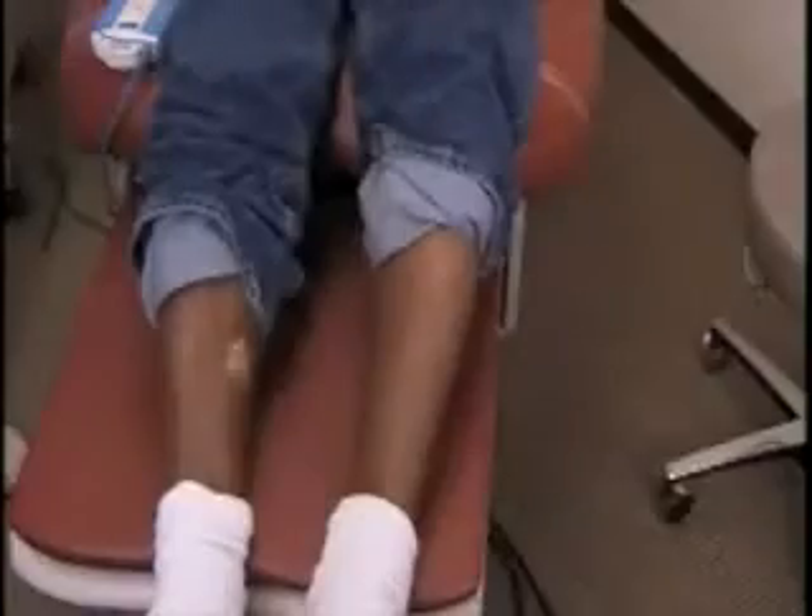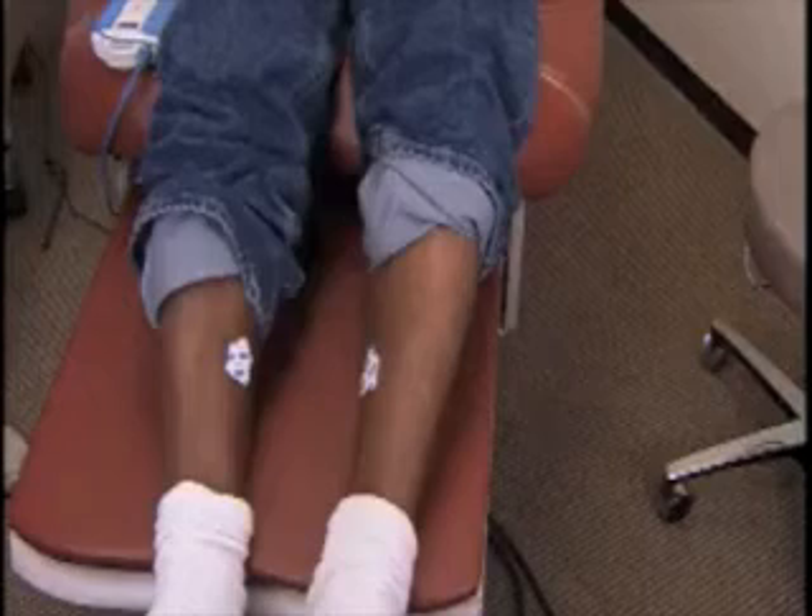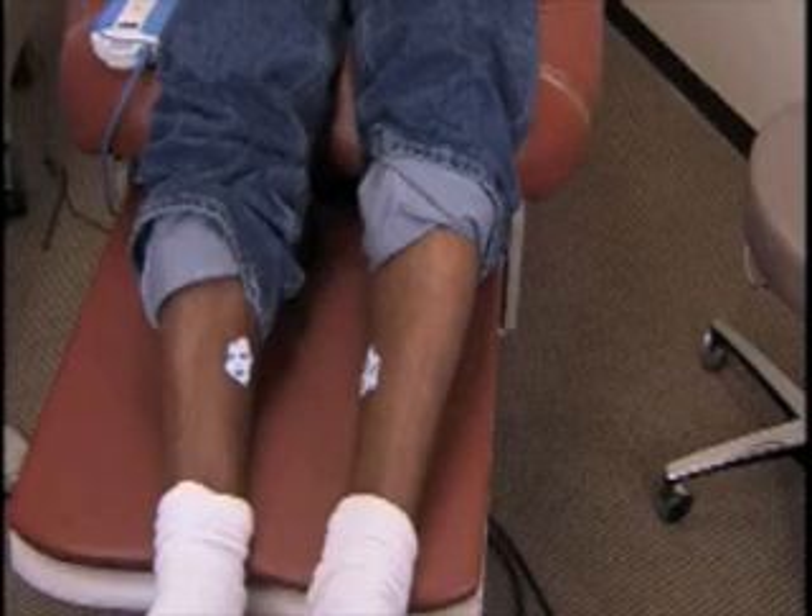Right leg: place the electrode with the tab facing up on the inside calf midway between the knee and ankle. Left leg: place the electrode with the tab facing up on the inside calf midway between the knee and ankle.